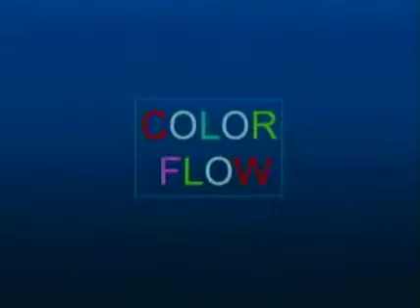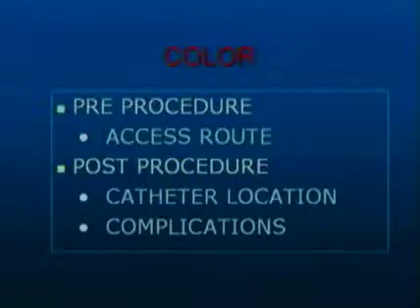Probably the most helpful thing that I find is use of color flow. Color flow not only is helpful pre-biopsy or pre-aspiration to avoid vessels, but it is very helpful post-procedure, and I'll show you that later in examples.